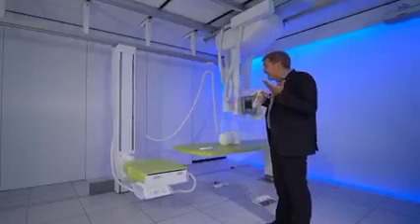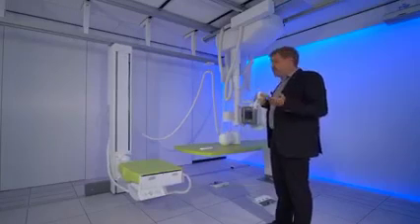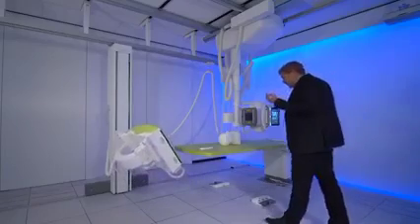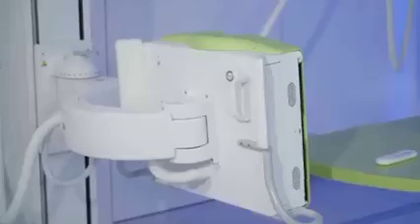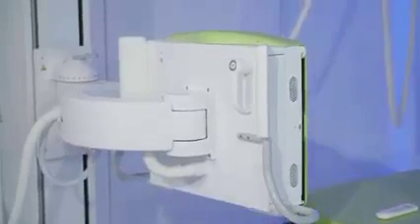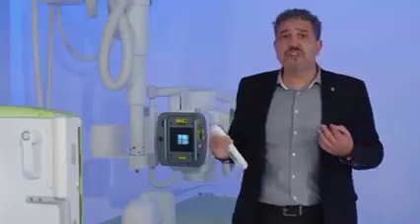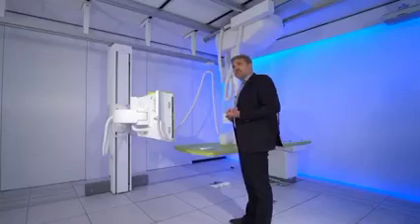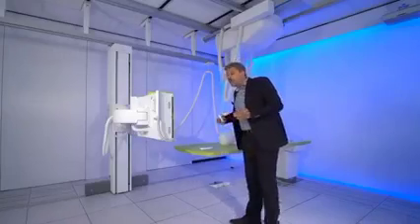Name this chest position anywhere you like it. For example, chest sitting on table. And why a chest sitting on table? Well, how many times do you not have a patient that's a little bit weak on the feet, has difficulty to stand, but is able to sit for a few minutes on his little stool in front of the wall stand? Because your optimal goal, of course, is to do your chest in an upright position.